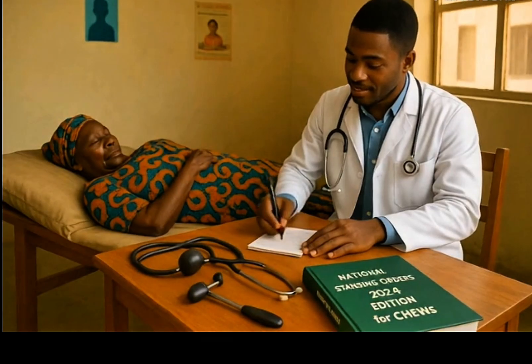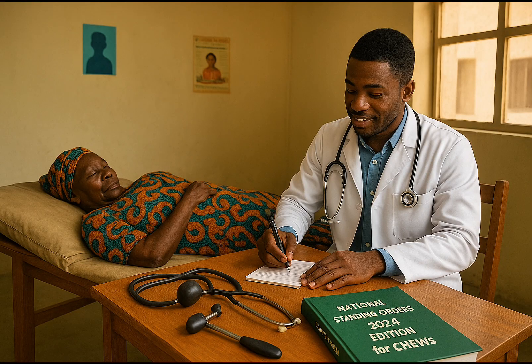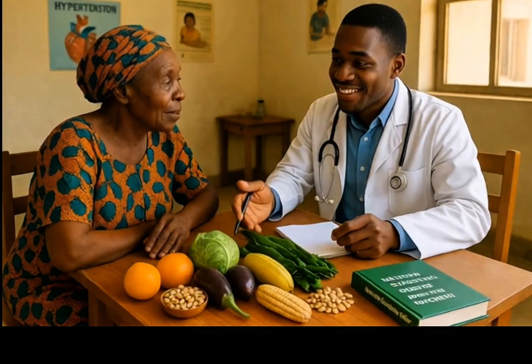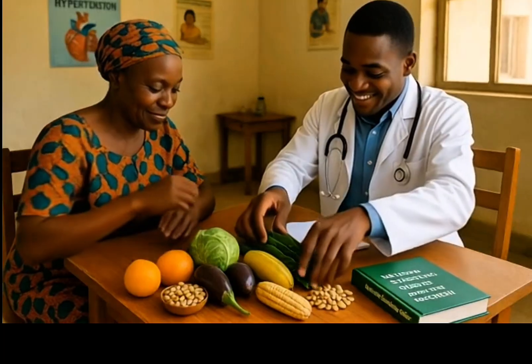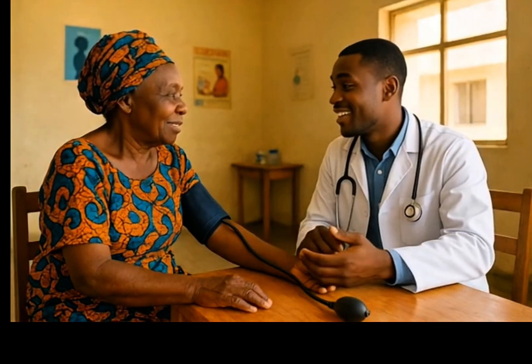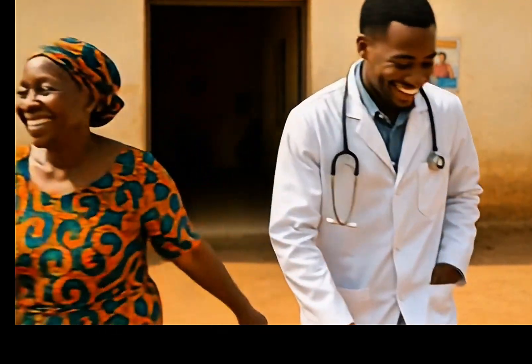Step 11: Reassure the patient and interpret the result. Thank the patient, explain the result in simple language, and give follow-up advice if the BP is abnormal. Reassurance reduces patient anxiety while interpretation and guidance promote adherence to treatment or lifestyle advice. Step 12: Manage according to national guidelines and standing orders, as evidence-based guidelines provide the safest, most standardized management pathway for hypertension or hypotension.